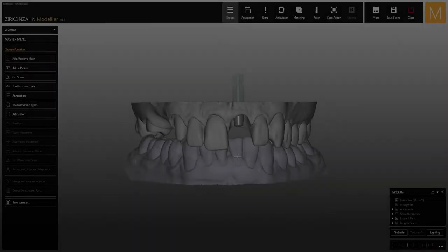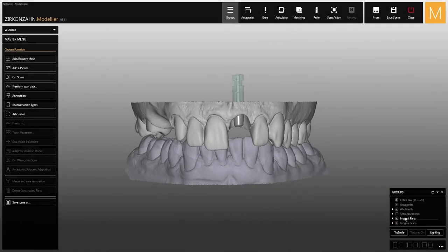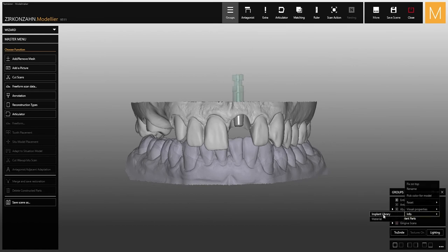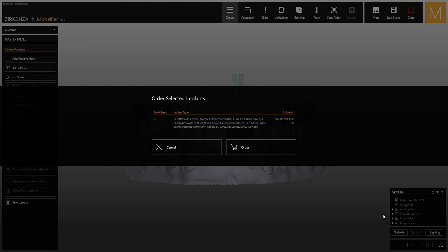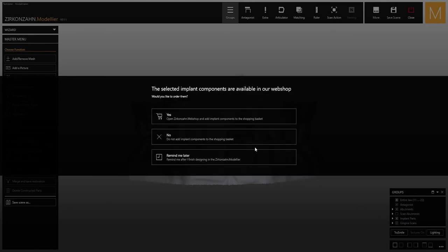If you skipped the order option, you can still order the implant components by right-clicking on the group window. If you select Info, the same window as before opens, where you can order the required items.